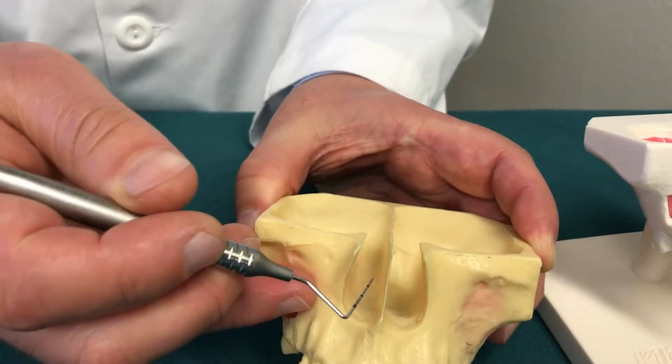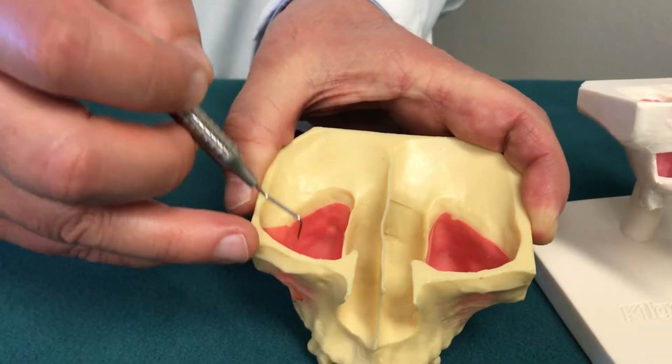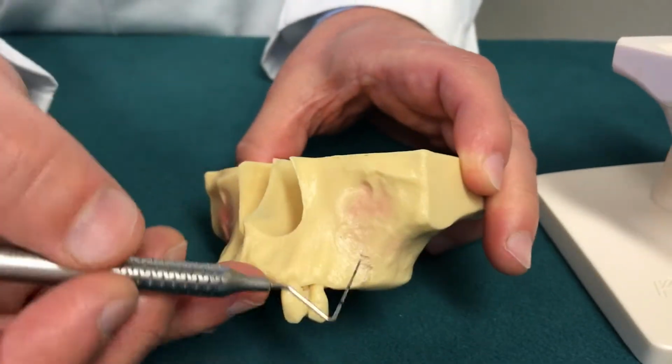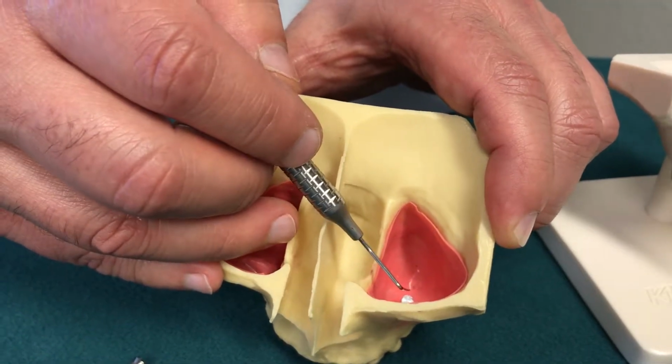Now, just to get an orientation here, this is the nose, this is the sinus area, right and left. So if I were to place that implant again from the ridge to the floor of the sinus, it will pass right through, and that implant will not be within the bone.